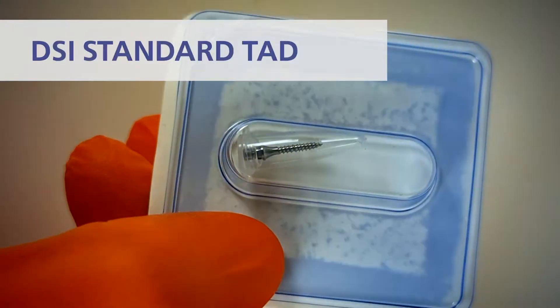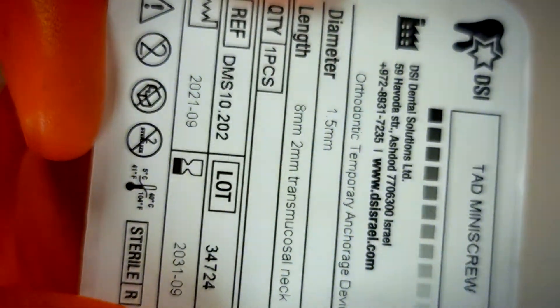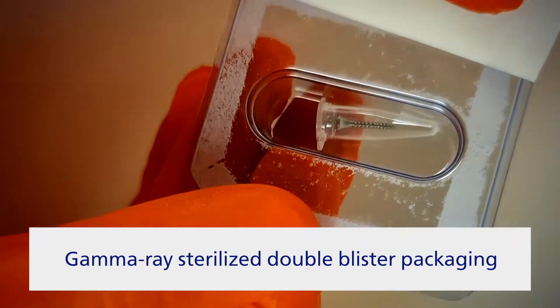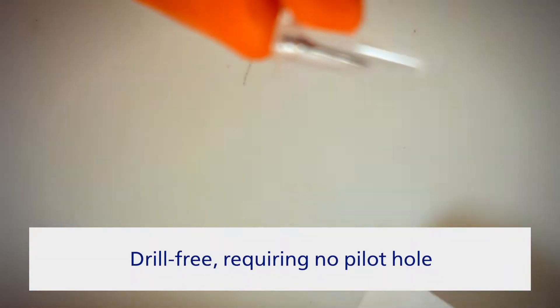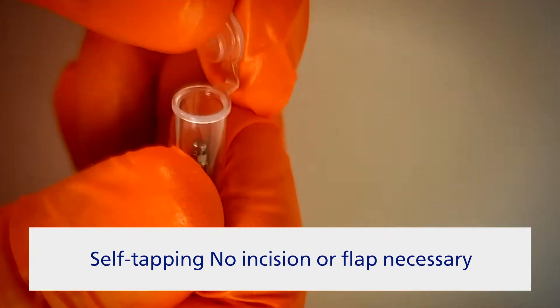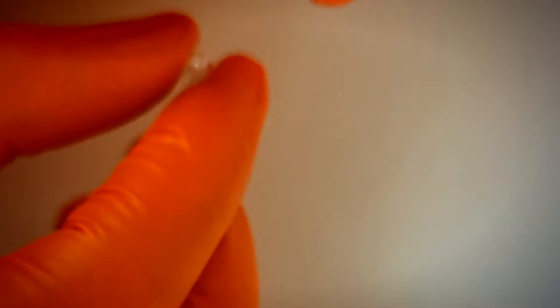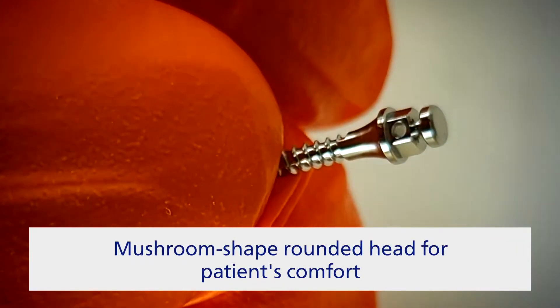Since it has no surface treatment, no integration happens, so after-treatment removal is easy. DSI TADS come pre-packaged in a clean room class 7, in a double blister sterilized by radiation. A self-tapping thread with active point and self-piercing tip profile is specially designed to offer stability and secure fit in bone texture, plus resistance to application of immediate orthodontic loads.